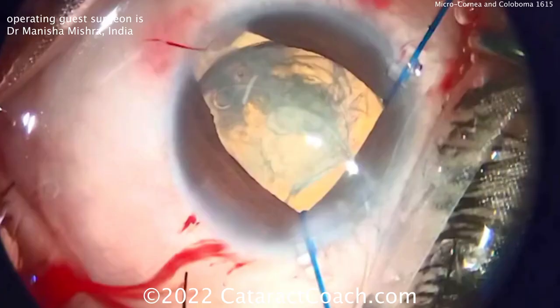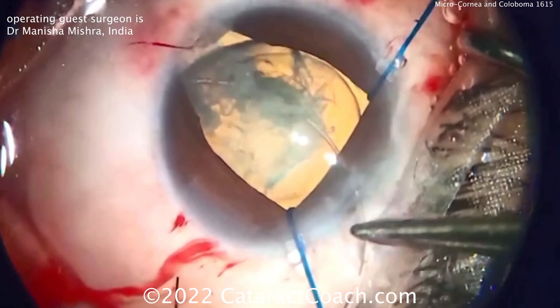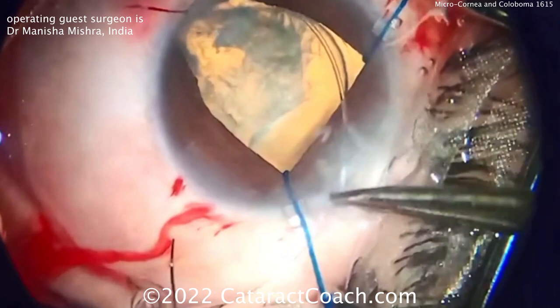In a case like this, luckily it's not a super dense cataract. A capsular tension ring is going in first — a CTR going in. Now you've got a CTR in the capsular bag along with the whole nucleus. Nice and easy — dial that around and let's see if we can see it coming around the other direction.